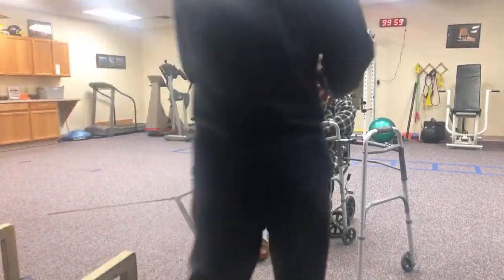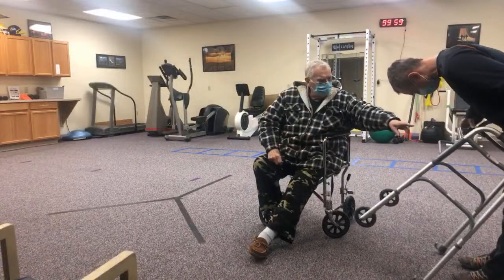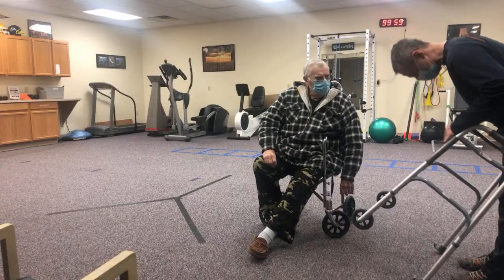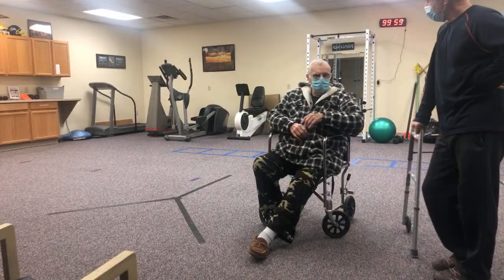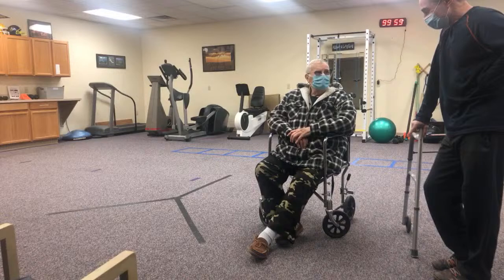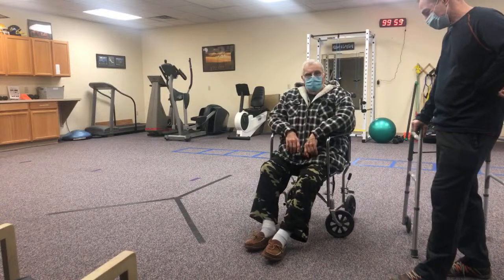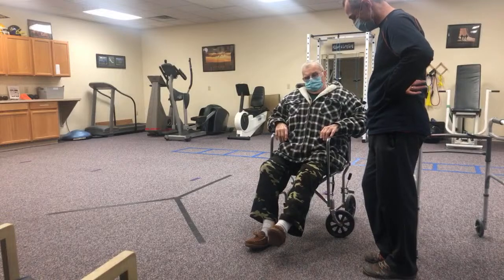So you got it - awesome. What was wrong with it? We talked yesterday about kind of lifting that leg. Let's see what you got. Okay, take a break.